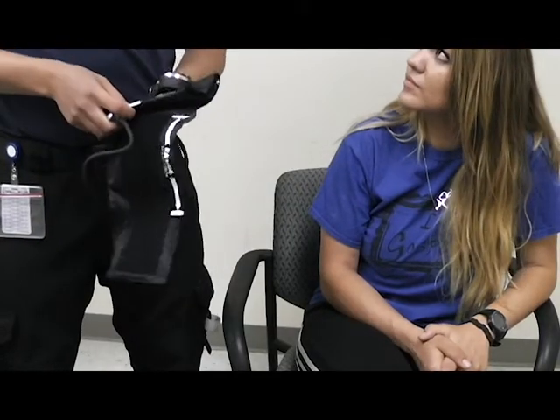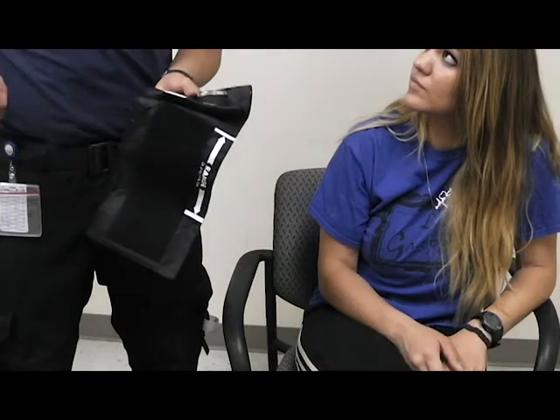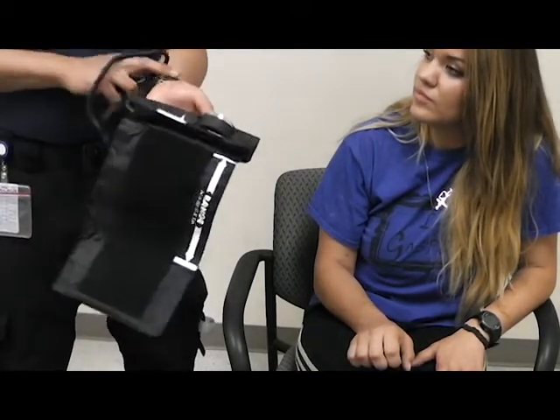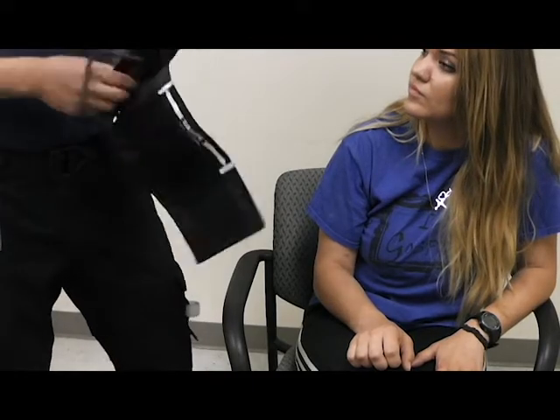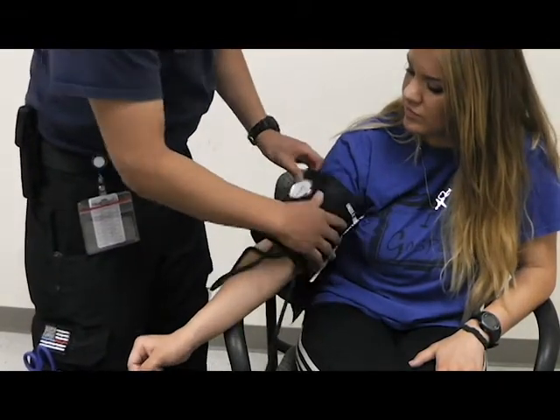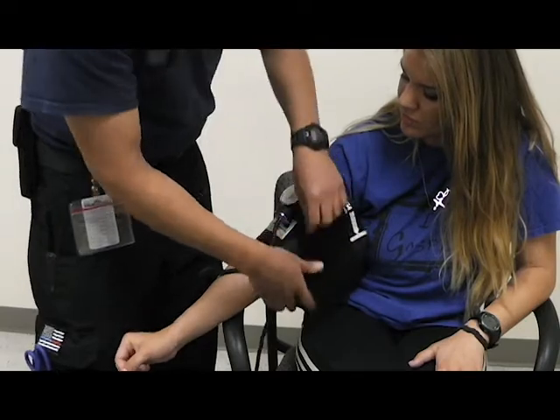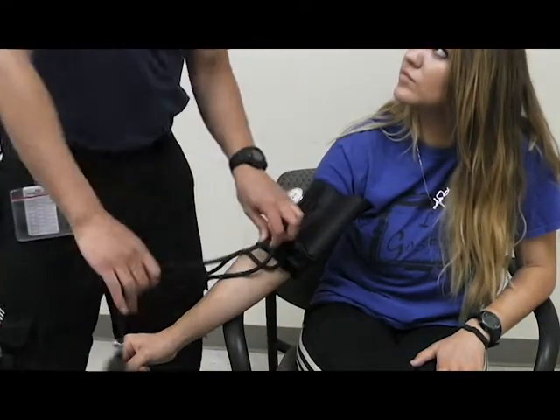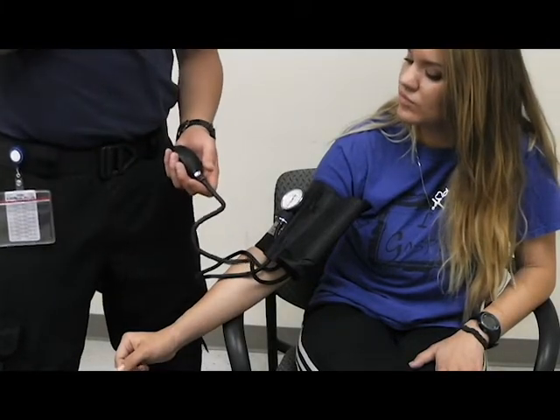Another method you can use for taking blood pressure is called a palpated BP. For a palpated BP, you take the radial artery and feel for a pulse. Once you've located that, apply your blood pressure cuff again in the same position. It's important to note that when taking a palpated blood pressure, you are only going to feel a systolic number because you're not using a stethoscope.